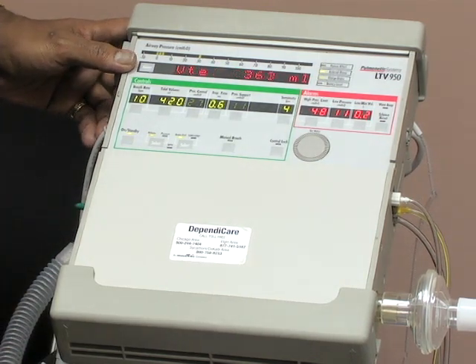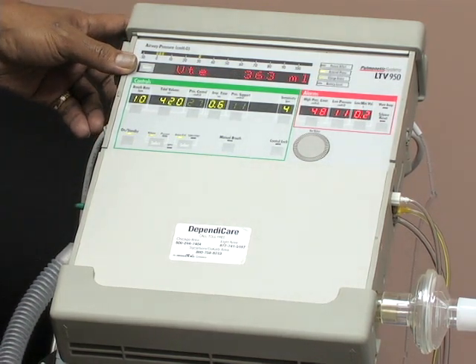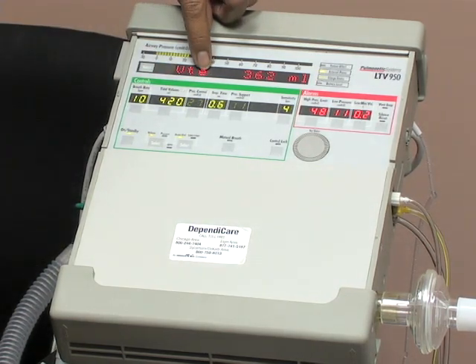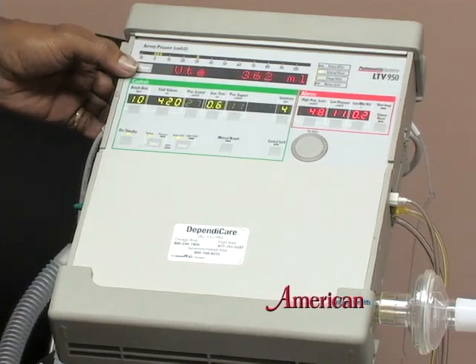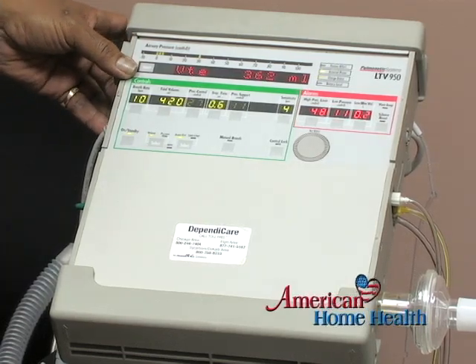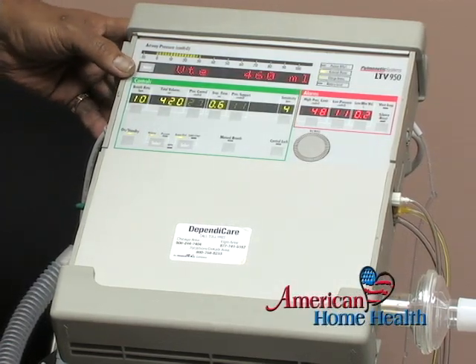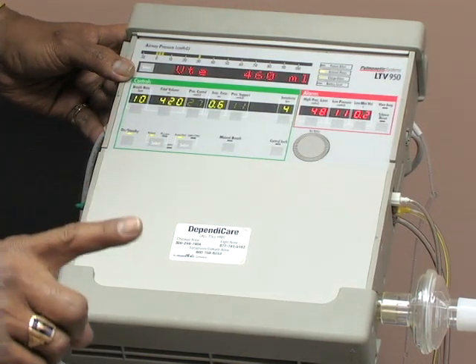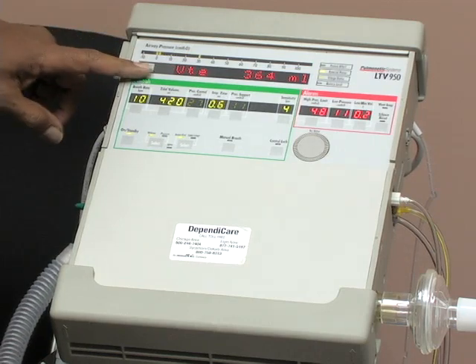Now let's look at our exhaled tidal volume, VTE. It's easy to read backwards, expired tidal volume, but it represents the amount of air in milliliters that has been exhaled or came out on each breath. This is a very useful reading.